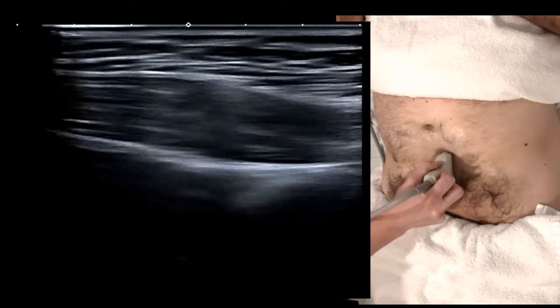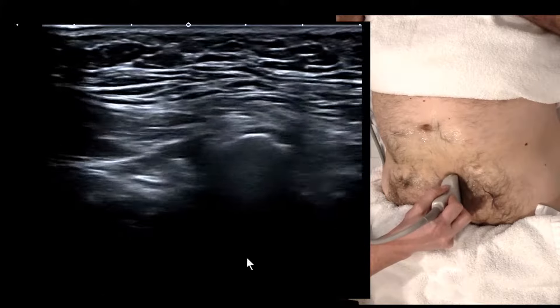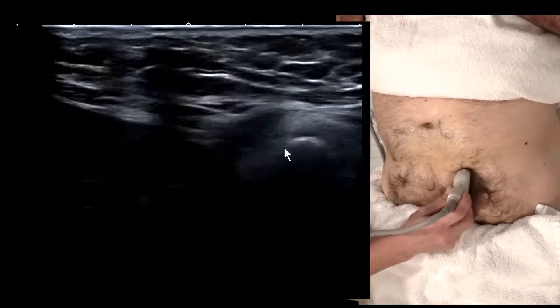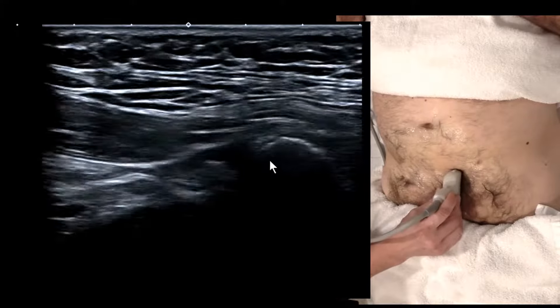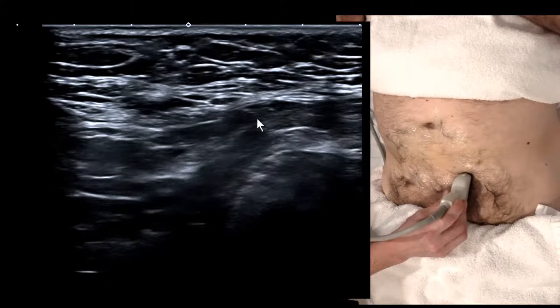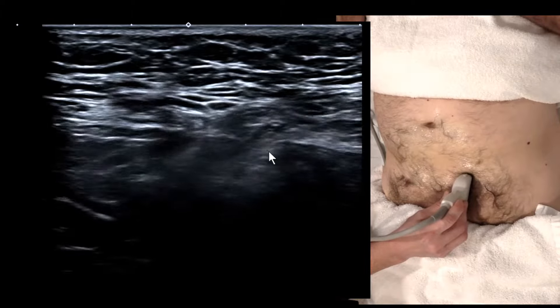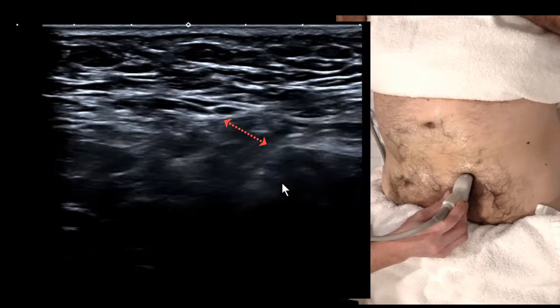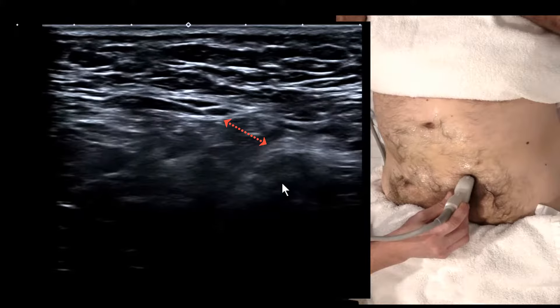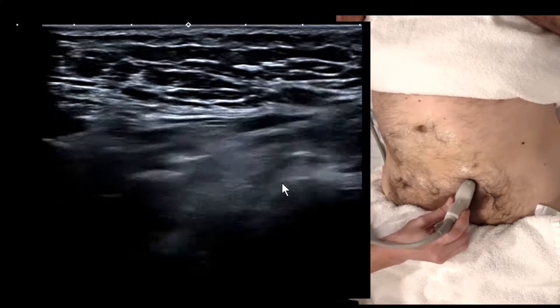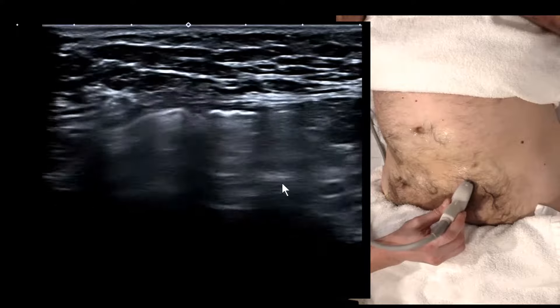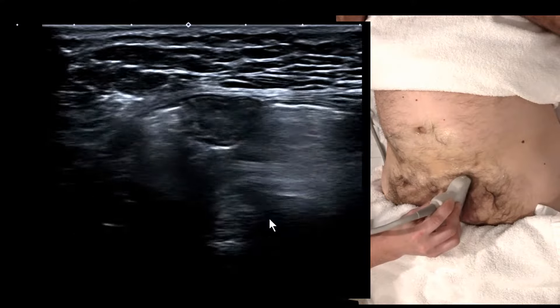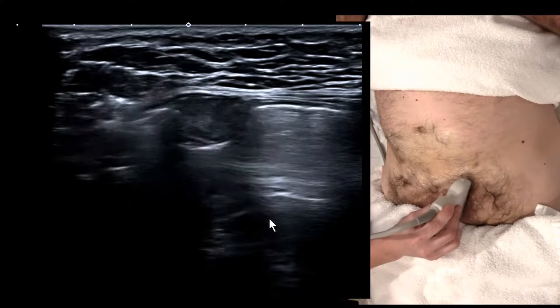When we follow the rectus abdominis down onto the pubic tubercle and move about a centimeter lateral, we fall onto the superficial ring. We can see something pushing out through this opening. At this stage you don't know if it's direct or indirect. If it's a large defect containing bowel and fat, it's more likely a direct hernia.